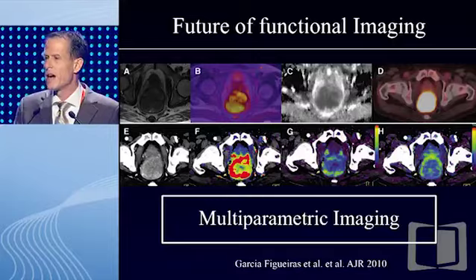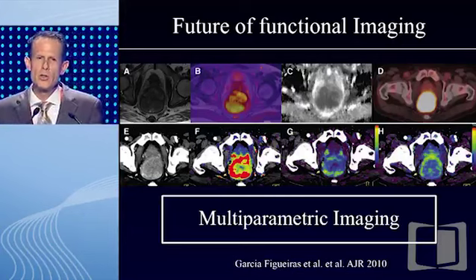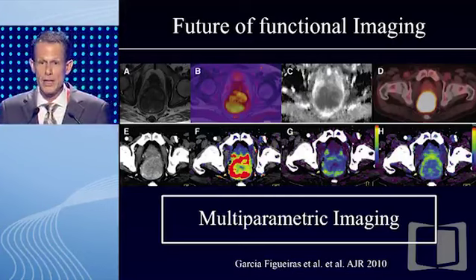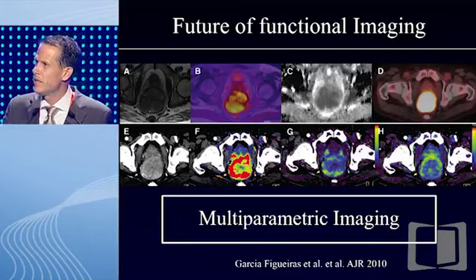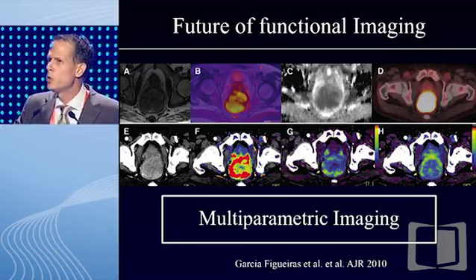And so my conclusion is that we really need to work together to establish those very nice tools. And how does the future look? This also has been mentioned today. I think we need to use multi-parametric imaging or individualized multi-parametric medicine. Not every tumor is the same. In some tumors, DWI might work, in another it might not. So we need to use different tools, not only DWI, but also morphology, clinical data, tumor markers, and PET imaging, and put it all together. And I think by this, we can get the best benefit for our patients.